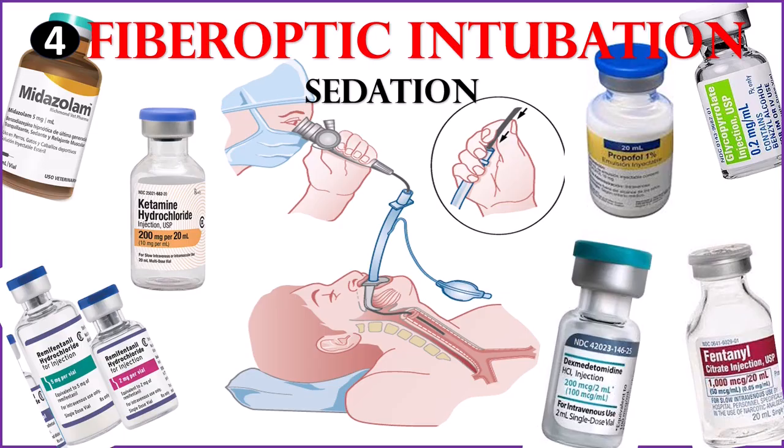Having looked into airway topicalization and nerve blocks in our previous sessions, we will now dive into how we provide sedation for awake fiberoptic intubation. So, let's start with a simple question: why do we even need sedation, when topicalization or nerve blocks already do a great job of numbing the airway? Well, the short answer is, sedation makes the whole process a lot more tolerable for the patient.